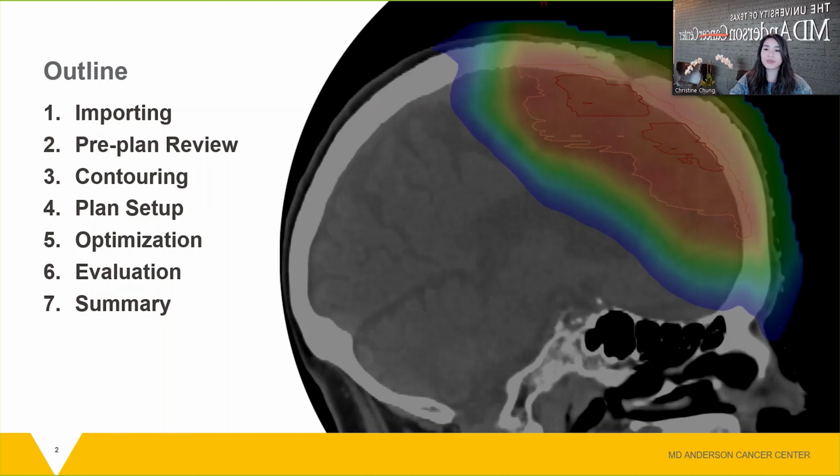I tried to curate different approaches that I learned over the years from the amazing team at the MD Anderson Proton Therapy Center, though nothing I present here can be used to reflect on every dosimetrist that's there. This outline is a generalization of the steps we go through from start to finish per proton plan, not including the follow-up steps such as verification and adaptive plans. I will also not include complicated cases such as those with combo plans with photons or cases with previous treatments, as those could be their own hour-long presentations.